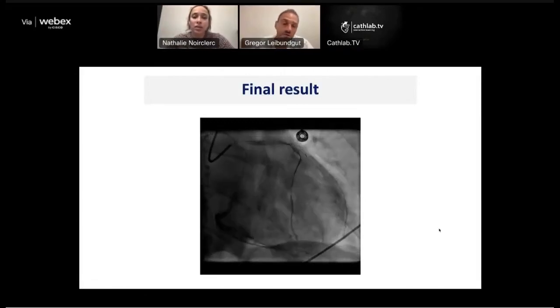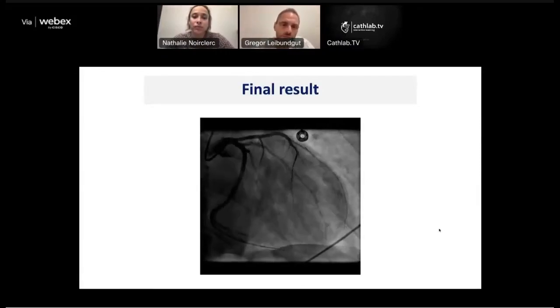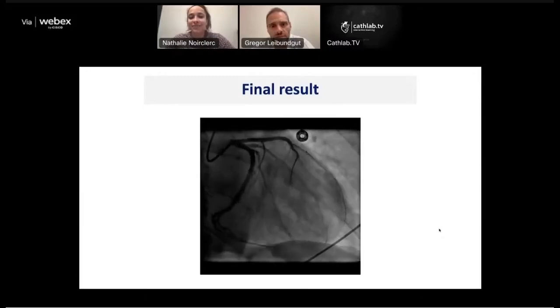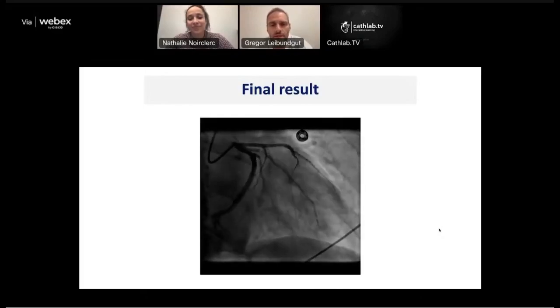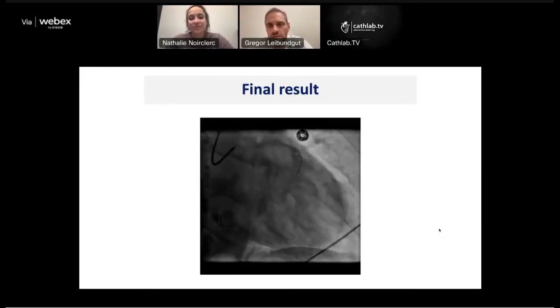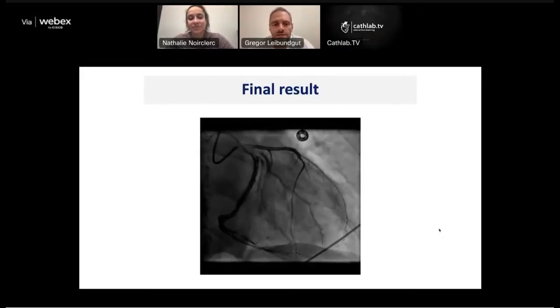Yes. And you don't have any other options. I mean, you can go 50 atmospheres or shock, which is acoustic 50 atmospheres. You can rotate the stent away, but it could be dangerous. You could do orbital atherectomy. This is all off-label. Cutting won't work because it's armored with the struts. Scoring won't work. So that's basically the only two options you have.